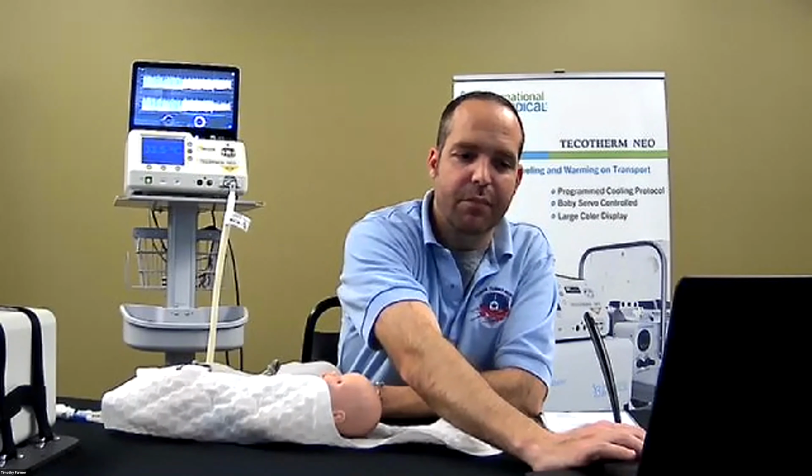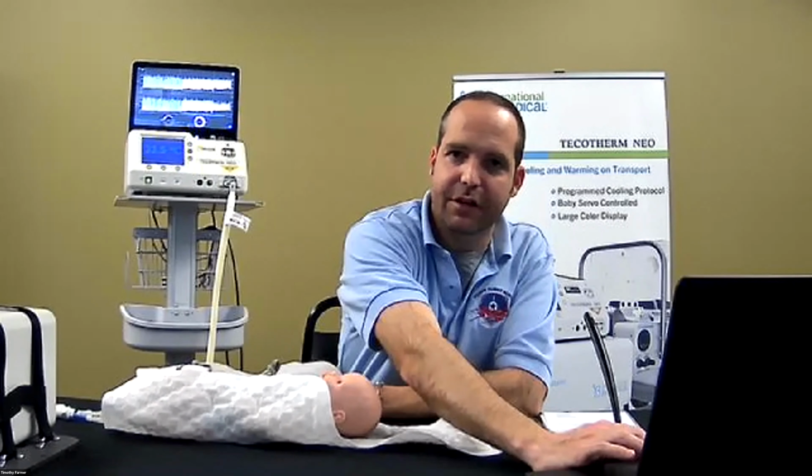And when we're comparing it with axillary temps and things like that on arrival, we're seeing it is doing what it's saying it's doing. That's great. And we've kind of validated it that way. That's great. Let's see, there is a question about maybe using it in the operating theater.